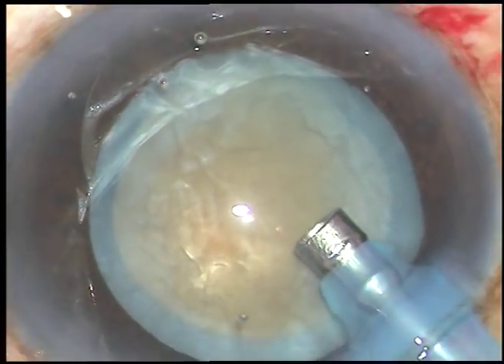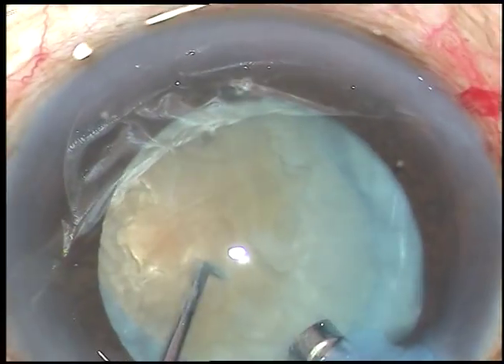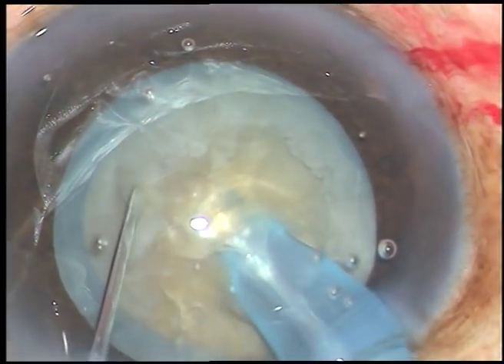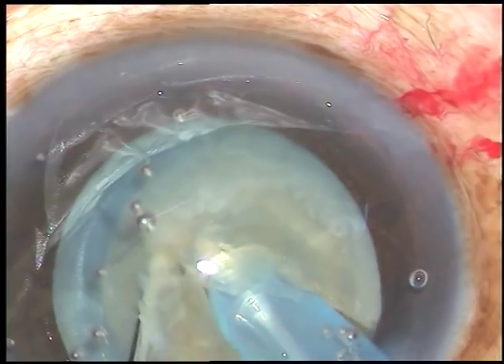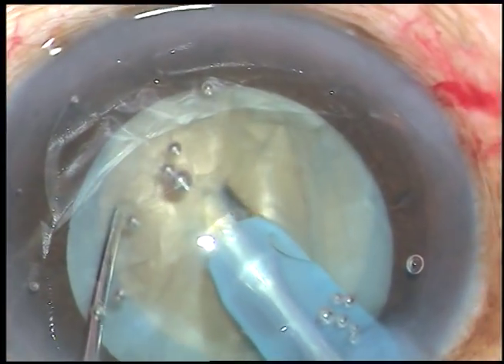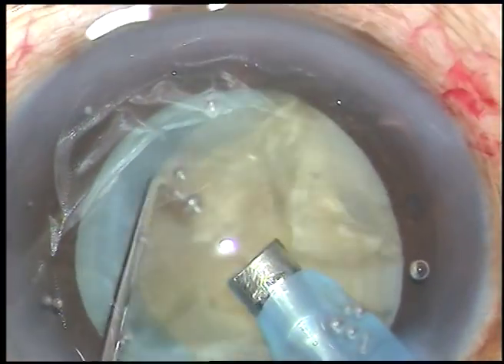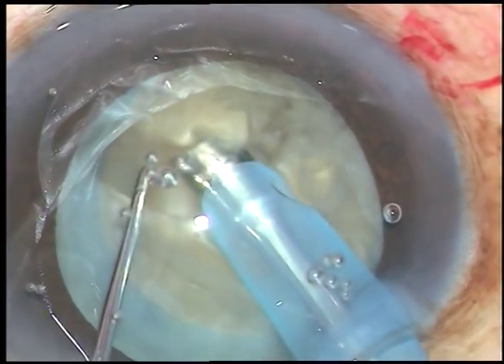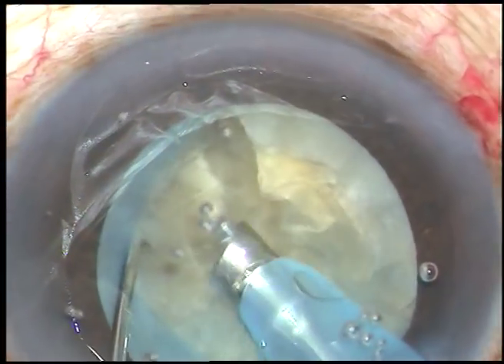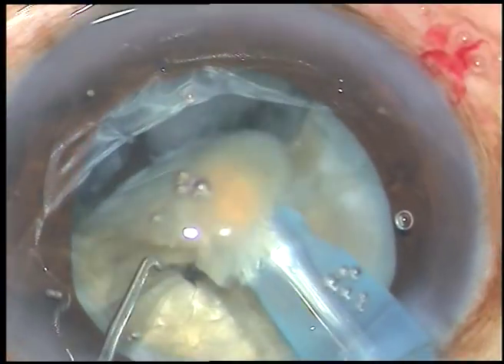In this case, I am going to do a direct chop which I call submarine chop. The tip is buried into the substance of the nucleus just in front of the main incision and travels through the substance of the nucleus towards the opposite equator. I am in phaco 2 mode. As it reaches near the opposite equator, it is chopped. It is then held at another place and again travels through the substance and is chopped. This part of the nucleus is held and along the first crack, the two fragments are separated. The nucleus has been divided into four fragments.